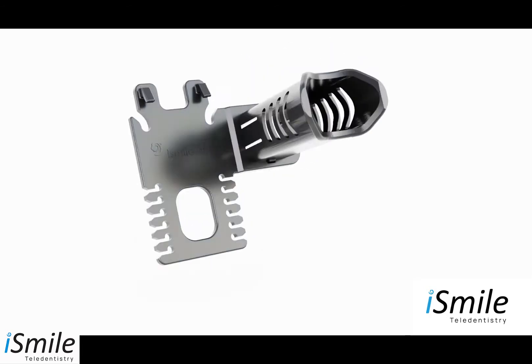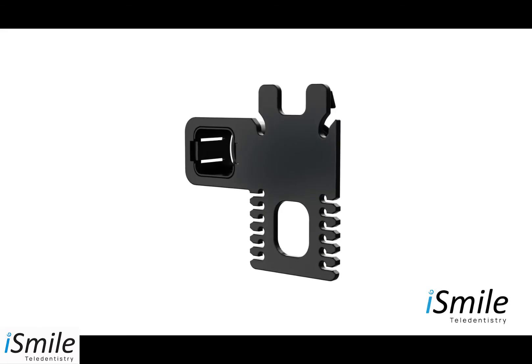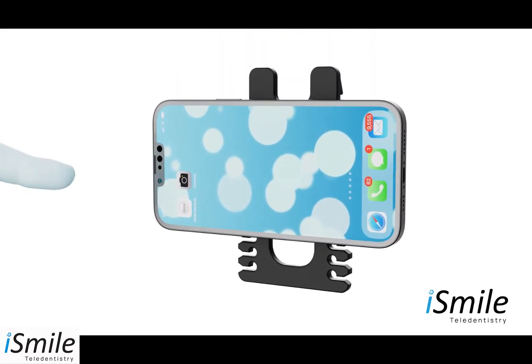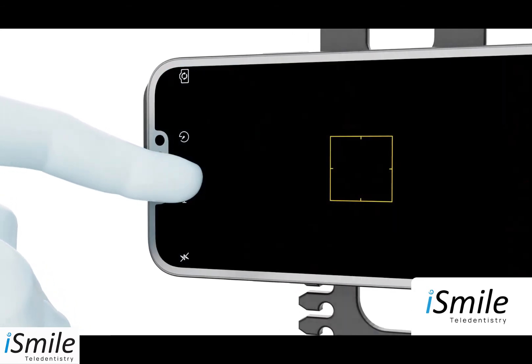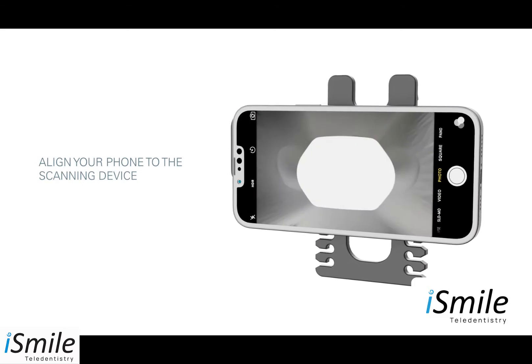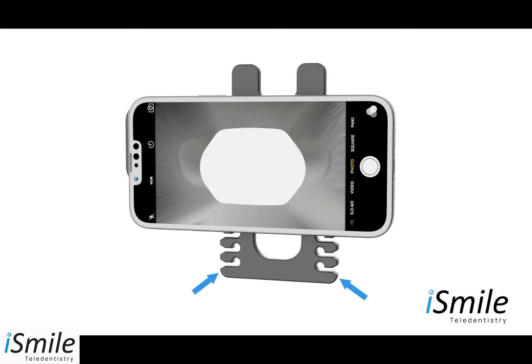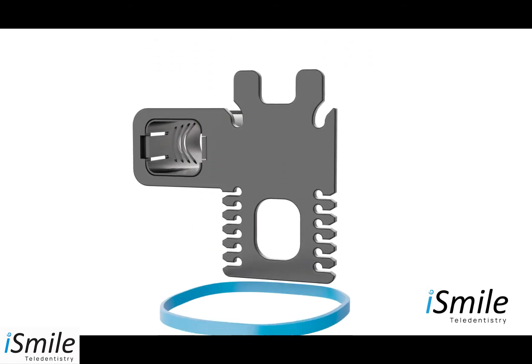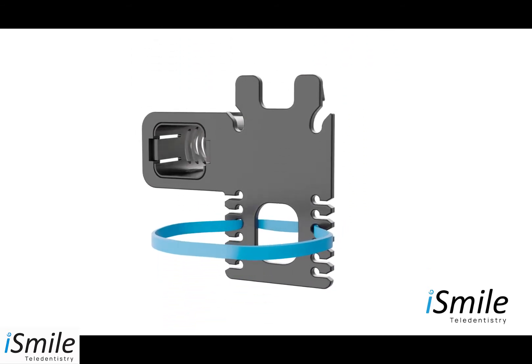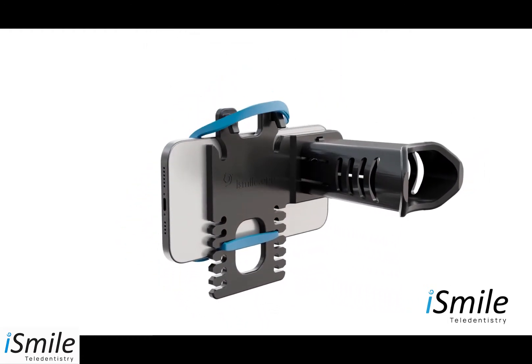Now you're ready to attach your phone to the remote scanning device in three easy steps. Step one: position your phone on the scanning device by opening your phone's camera app. Align your phone so the camera is looking through the scope and the opening of the scope is centered on your phone's screen. Count the number of ridges from the bottom of the scanning device to the bottom of your phone. Step two: take the band and insert it into the proper position. Step three: place the phone into position and wrap the band over the phone, securing it in place.